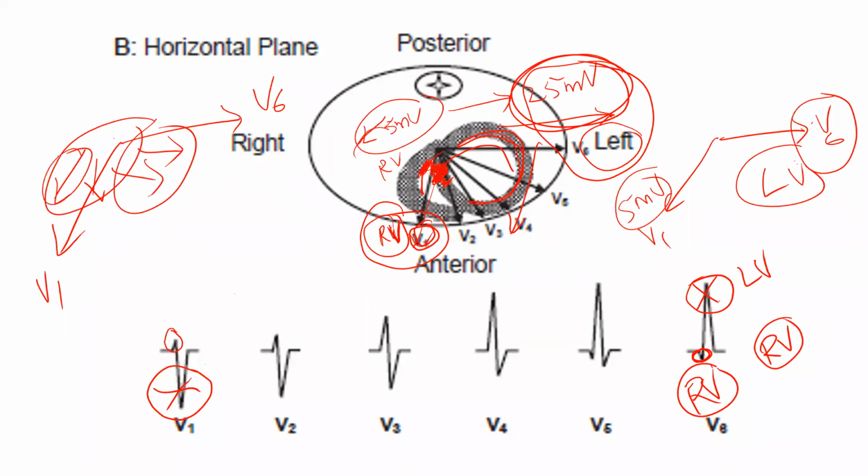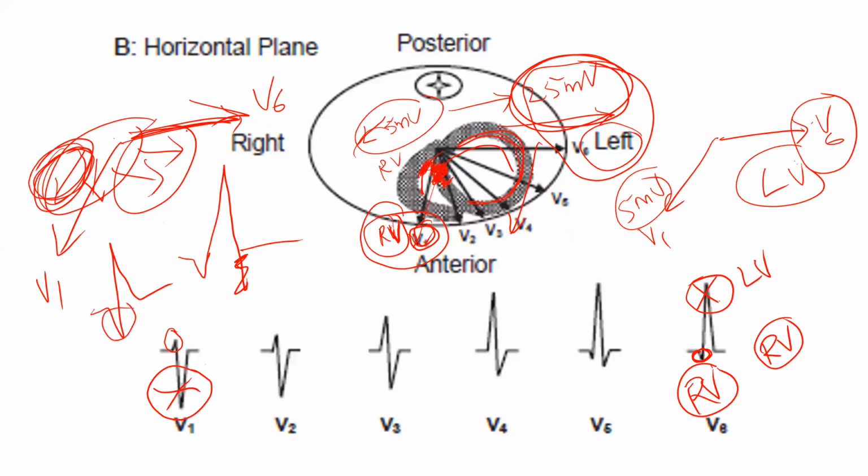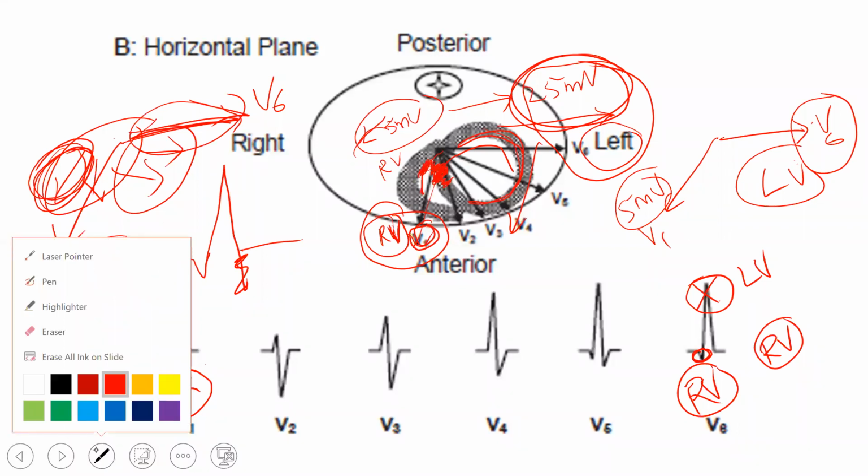This negative is depicted, this waveform which is there, this is V1 which is negative, and this is positive. So, this is a negative, this one will not come here, sorry. So, this is the activity which you have got. This part of activity is by this one, and this big activity is by V6. If you are not understanding, I don't know how better I can explain.